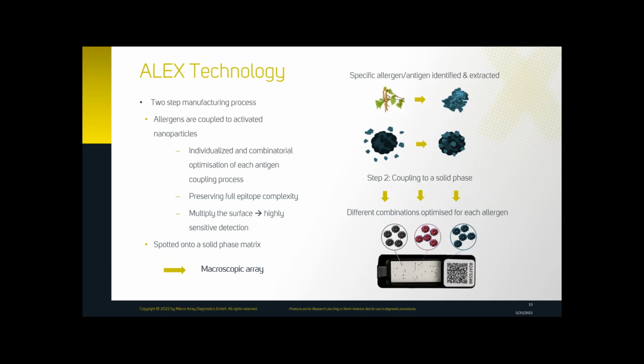Also, the nanoparticles multiply the surface of the solid phase, presenting the antigen during the immunoassay and thereby enabling highly sensitive detection. In a second step, the antigen-bearing nanoparticles are deposited contact-free onto a solid phase matrix, forming a macroscopic array of individual assay parameters.